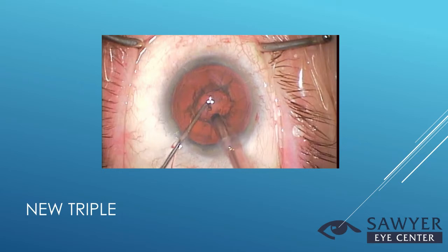Once it's centered nicely, and we know that the endothelial side is down, that's what the S stamp is for. We're going to put an air bubble in to press the graft onto the posterior cornea. Now I'm equalizing the pressure in the eye and managing the size of the gas bubble, and we're done. That's the new triple procedure with a DMEK.